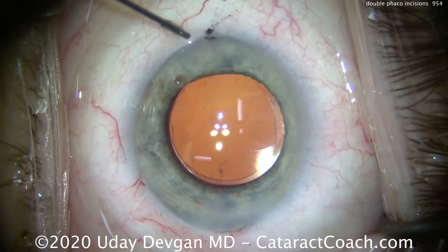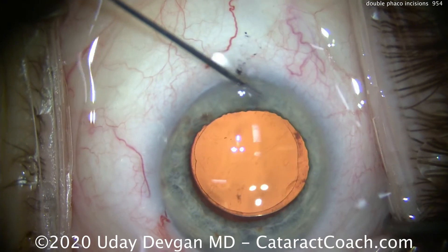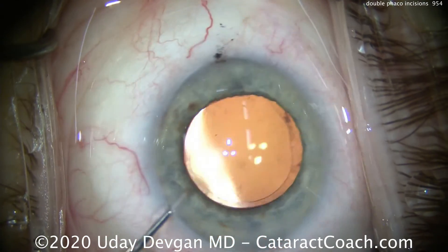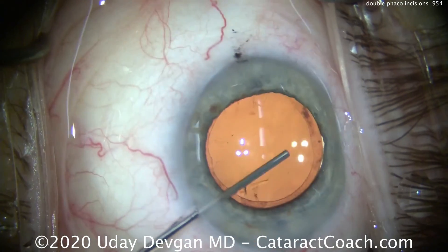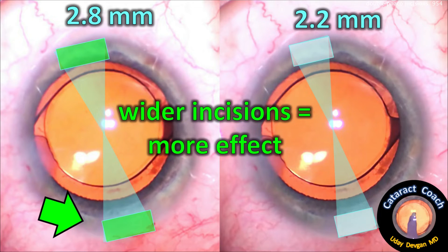This is a very good technique for treatment of astigmatism in the lower ranges. In the USA, the lowest-power toric lens available corrects one diopter at the cornea, and in a patient with 0.75 diopters of astigmatism a toric lens would over-correct — especially when you add the main incision flattening. Incisional approaches are important: a wider incision has more effect, so a 2.8 mm incision causes more flattening than a 2.2 mm incision.